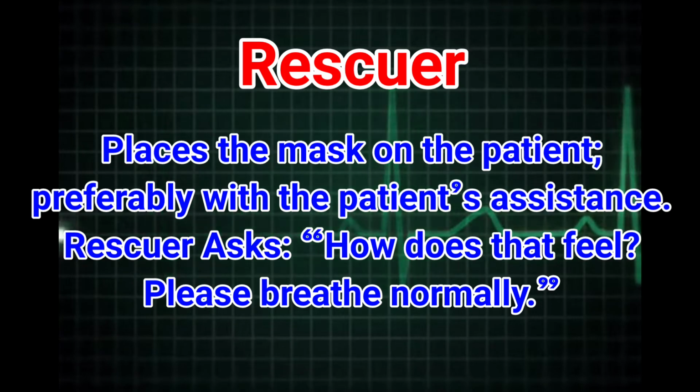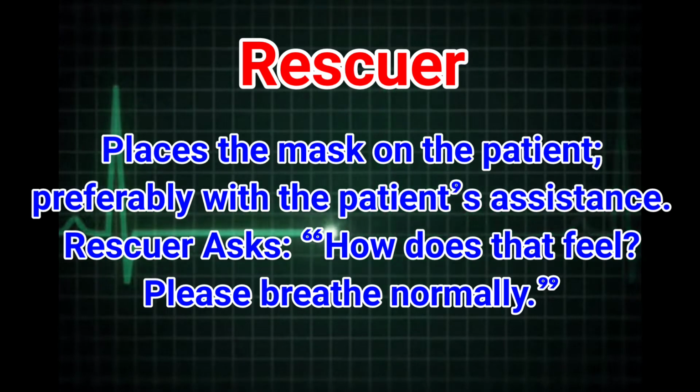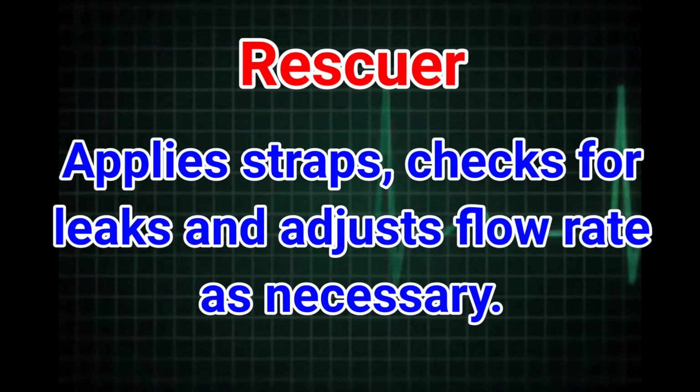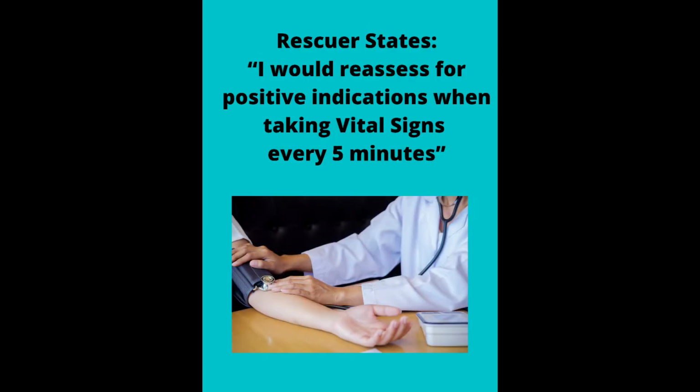Rescuer places the mask on the patient, preferably with the patient's assistance. Rescuer asks, "How does that feel? Please breathe normally." Rescuer applies straps, checks for leaks, and adjusts flow rate as necessary. Rescuer states, "I would reassess for positive indications when taking vital signs every 5 minutes.